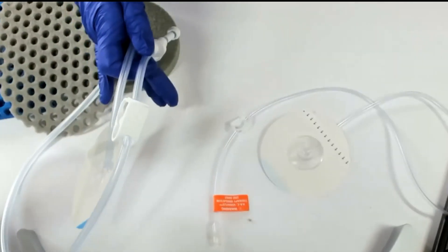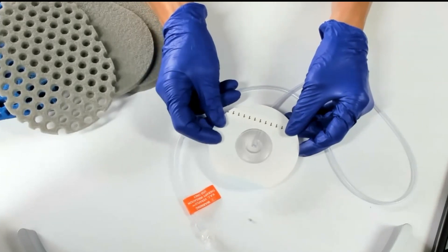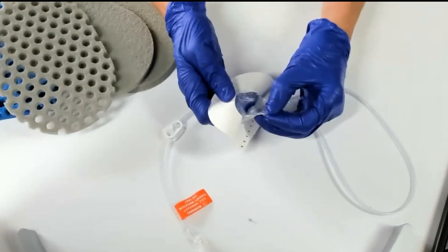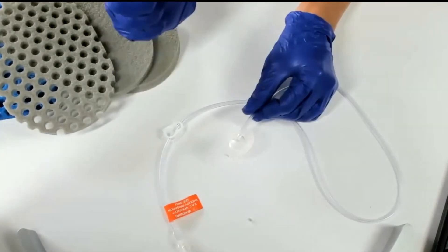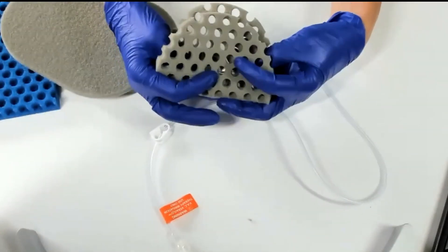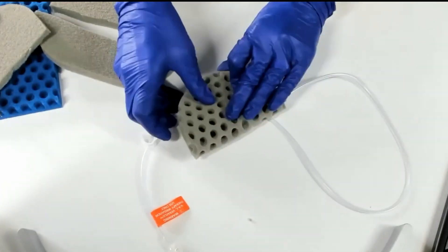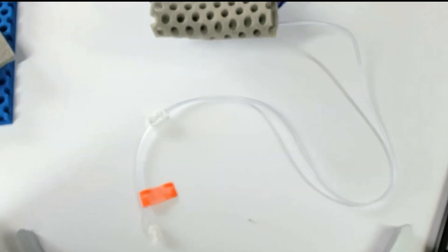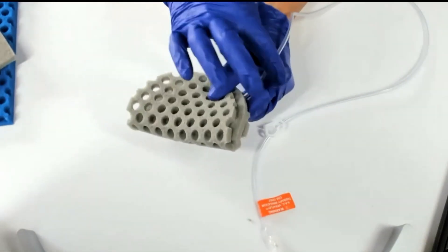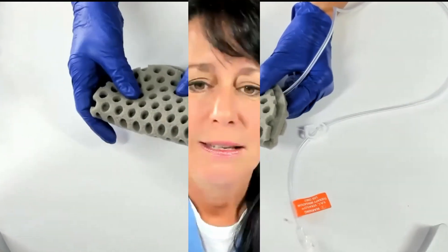You can Y in as many of these as you need. We want to make this little port friendly to go in there, so you don't want the paper or sticky drape on it — just peel it off. Then take this and, say you have undermining this wide: you put the port in the middle, take a piece of foam that fits appropriately, and tuck that in so it's laying flat. We call it taco-ing or sandwiching. Then you just stick that into your undermining, and the tubing comes out through the skin. Sometimes I use a little bit of hydrocolloid to wrap around this so I don't have an air leak, then drape all over the entire wound. Super simple — that's our skin sparing technique.